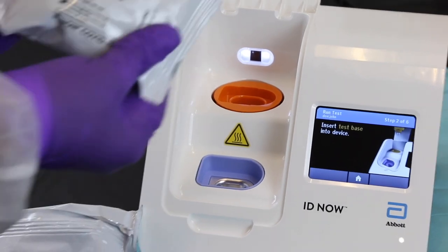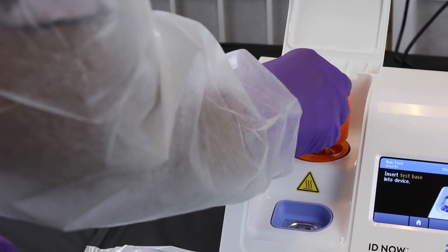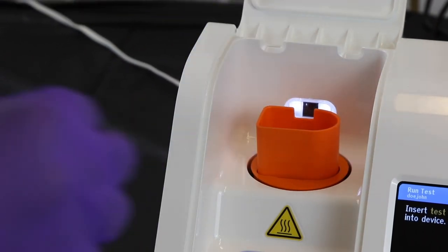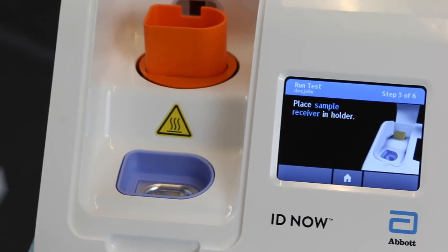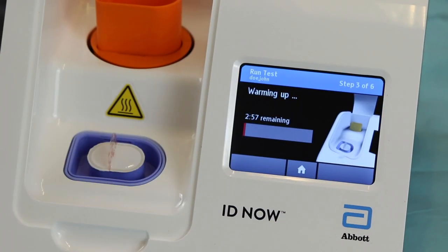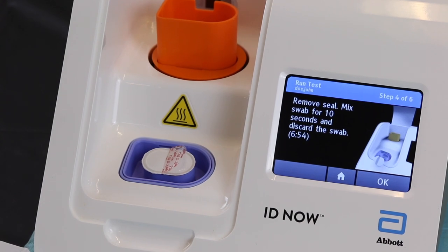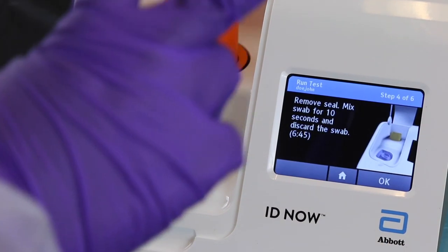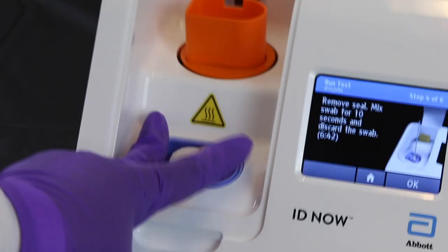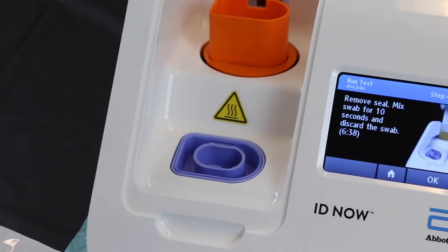Open the lid. The machine will instruct you to get your orange base from package one and place it into the orange well with the QR code facing the light. Wait until the machine recognizes the orange base as inserted, then proceed to putting the blue receiver from package two into the blue well. Leave the foil on the receiver. Once in place, the machine will run a three-minute warm-up. Once the warm-up is complete, use your index and middle fingers spread apart to hold the receiver down while carefully pulling off the foil to expose the fluid inside. Be sure not to lift the receiver out of the well. You have seven minutes to collect the specimen or it will time out.